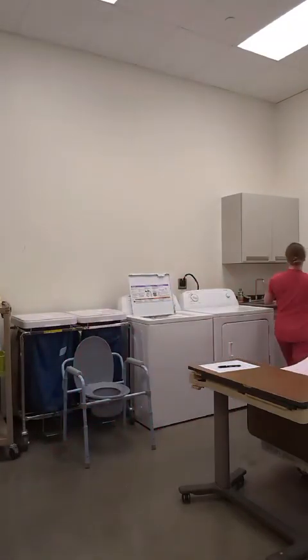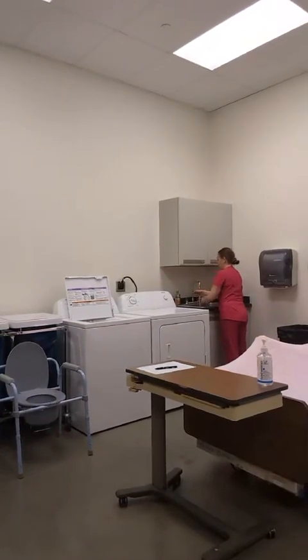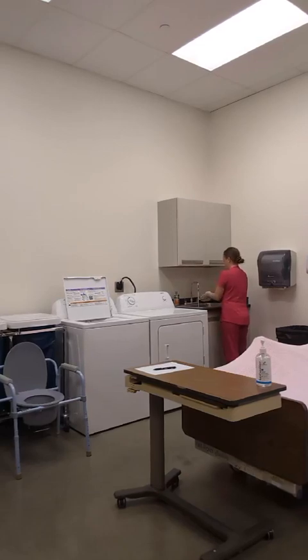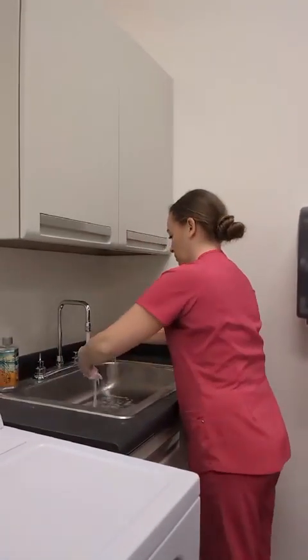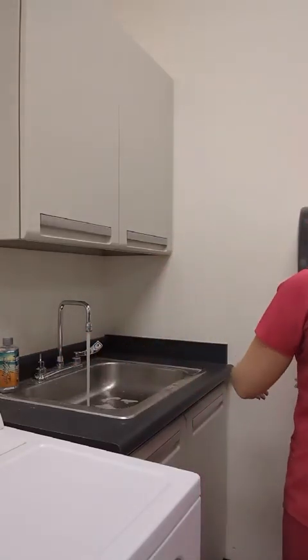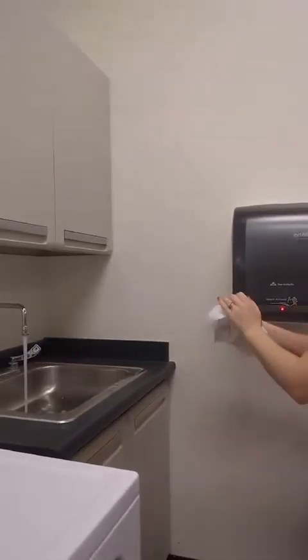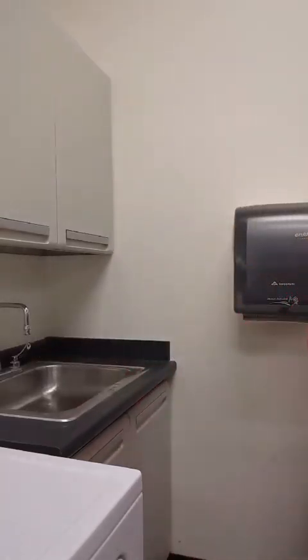Now I will perform hand hygiene by washing my hands, making sure that I wet all areas of my hands, applying soap to my wet hands, and using friction for 20 seconds, washing all areas of my hands including my wrists. I will dry my hands immediately, discarding my paper towel, and shut off my water with a clean paper towel and discard it immediately.